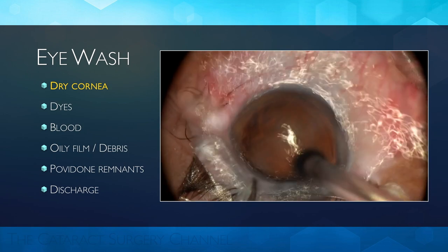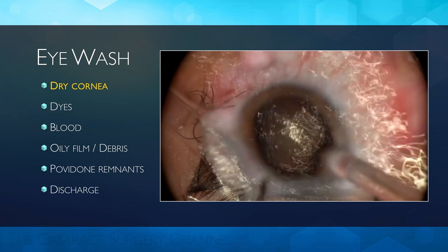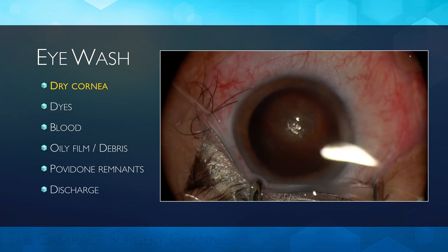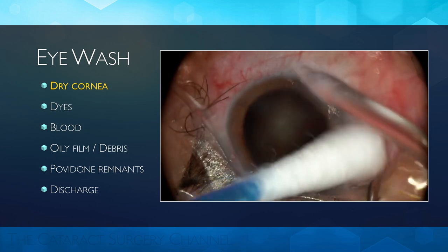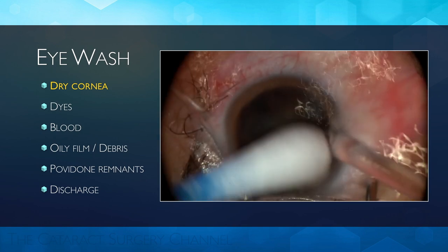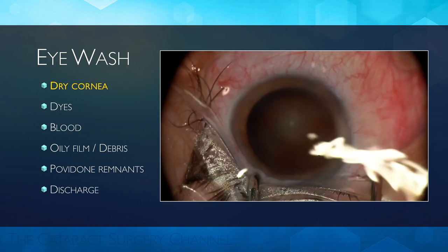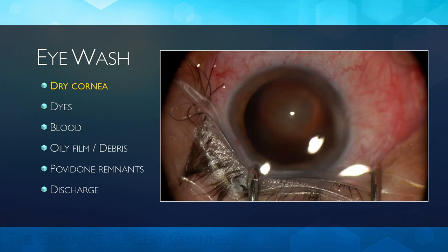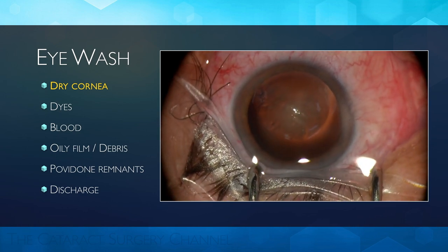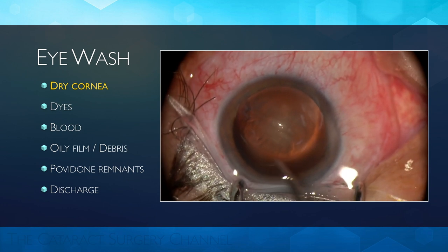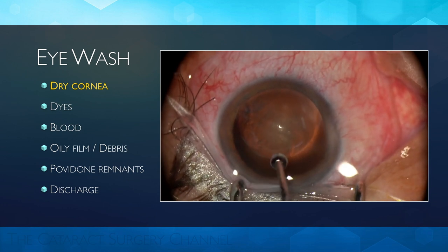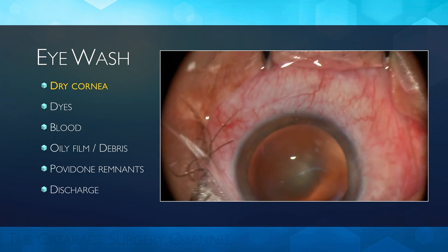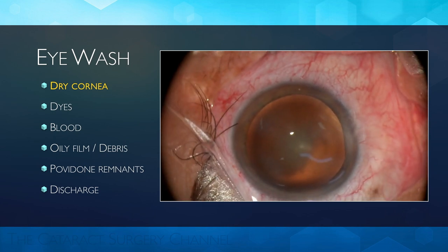Of the situations requiring eye wash, a dry ocular surface is one of the most frequent. A dried corneal epithelium covered with hydrophobic material is a challenge to good visualization. Copious washing, aided by Q-tip mechanical action, is needed. Subsequently coating the eye surface with dispersive OVD resolves the problem.